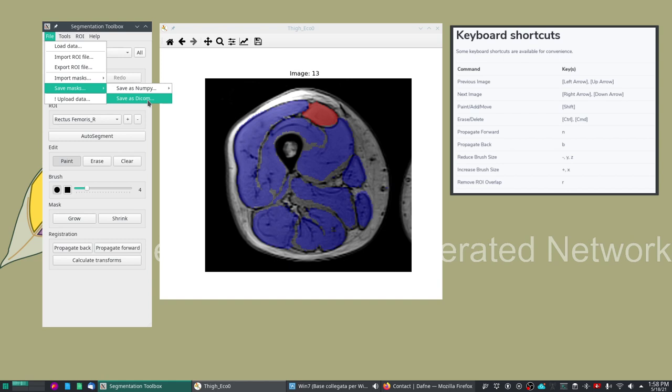The software will automatically align the masks based on the DICOM headers.